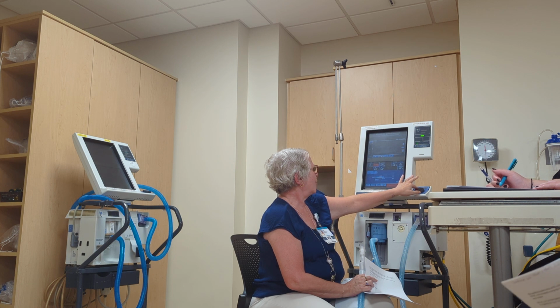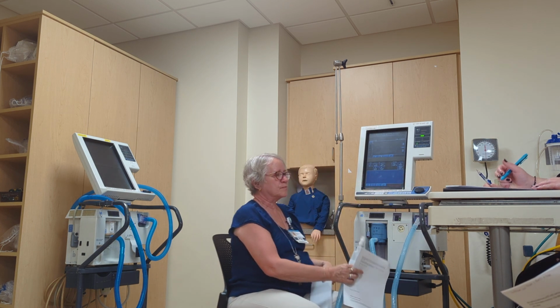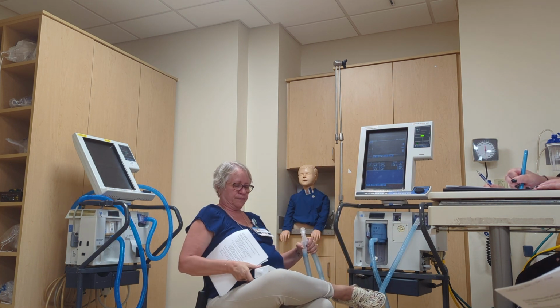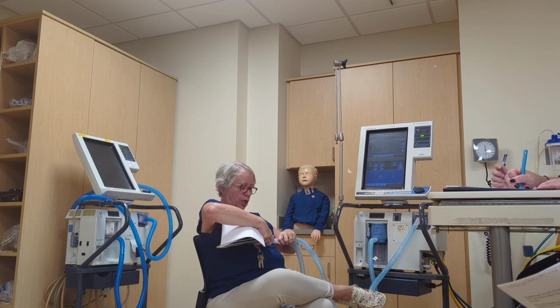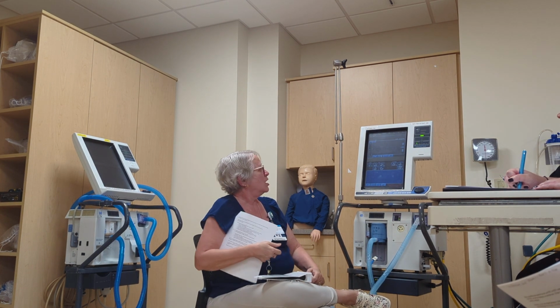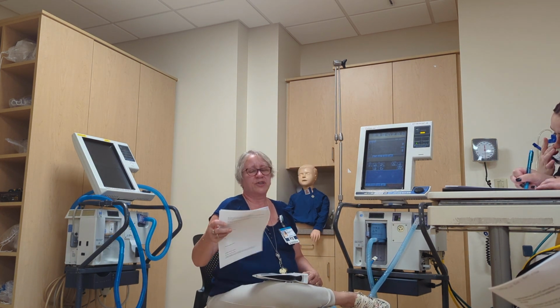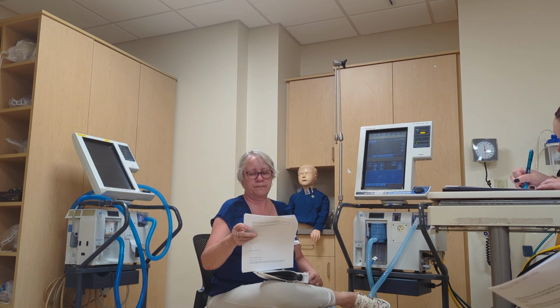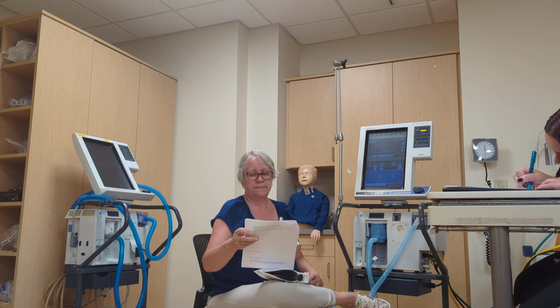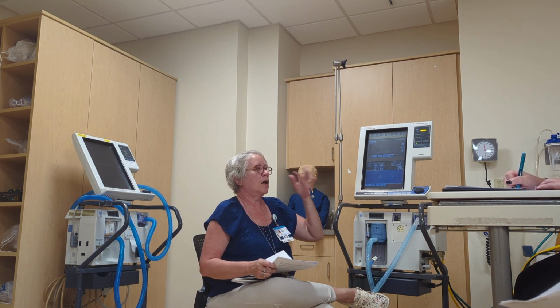So for the 10 breaths, I'm gonna deliver 500. When I connect my patient, I wanna look at my peak inspiratory pressure. 27, okay? You record the 27 now. Got that?